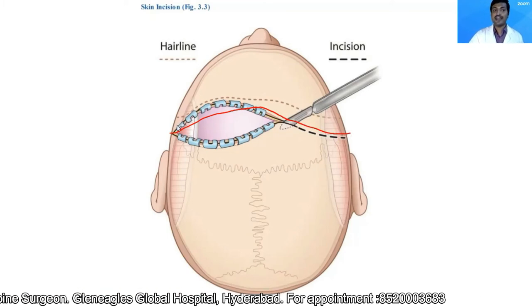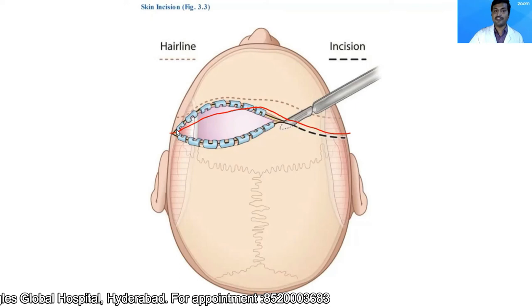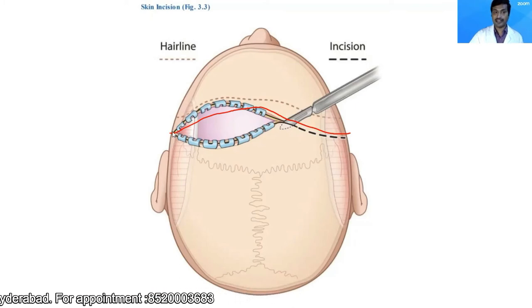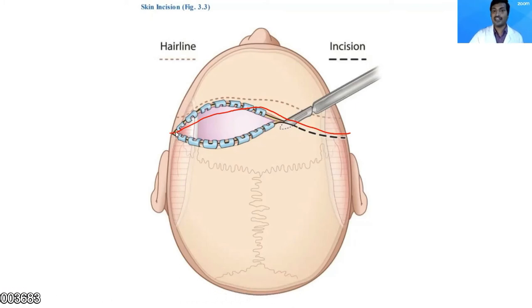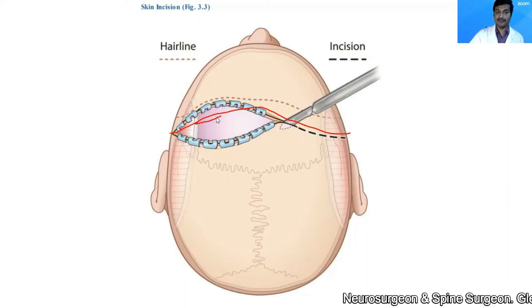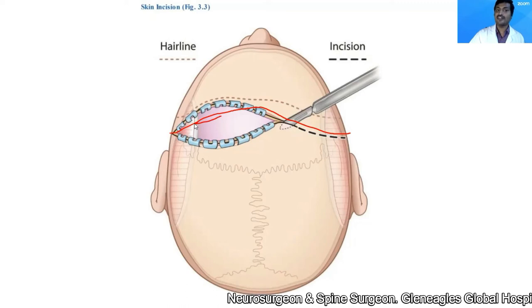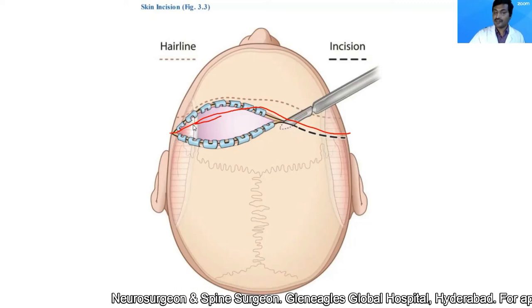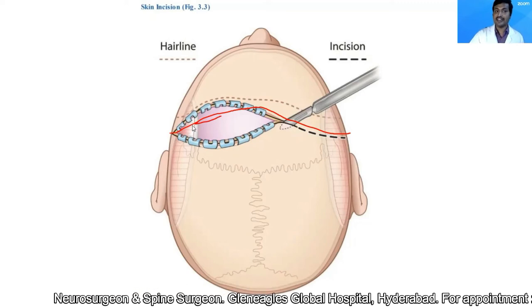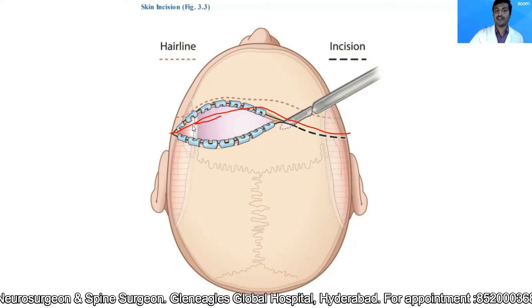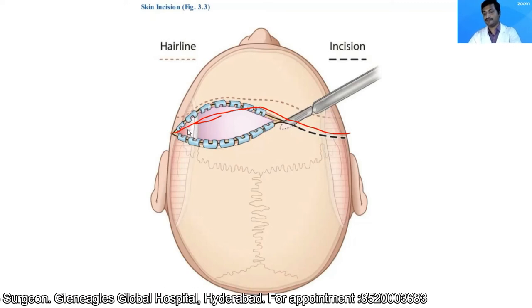I use a number 10, 11, or 15 blade surgical scalpel to incise the skin down to the level of the pericranium. Above the superficial temporal line, and below it, I take the skin incision down to the level of the temporalis fascia.